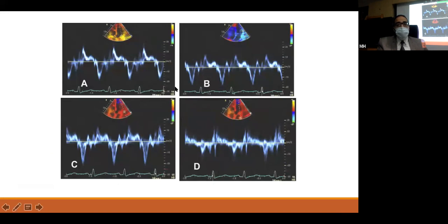Importantly, you should do it carefully to be sure that the sample volume is in the accurate annulus. So here it's correct, but here it's actually outside the heart. Here it's in the left atrium. Here it's just low. So it's very important to have an accurate E prime: get a good apical 4-chamber view, identify the annulus properly, and put the sample volume there. Also, decreasing the sector width helps a lot to get an optimum annular E prime velocity.